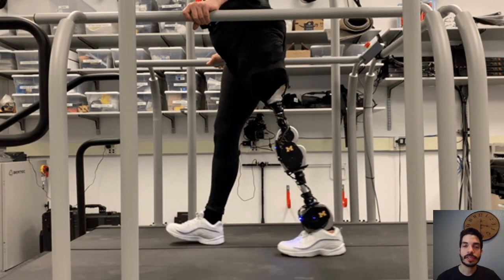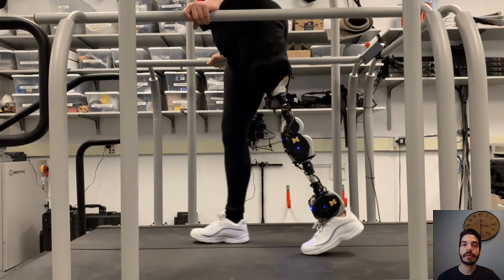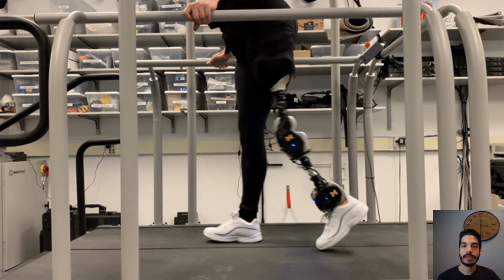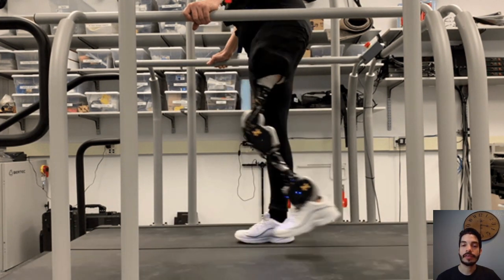Using the same state machine, with minor additional tuning, we can also generate realistic and meaningful walking patterns on patients with amputations. Here's a video of our lab's first patient walking with the leg after about 30 minutes of tuning.